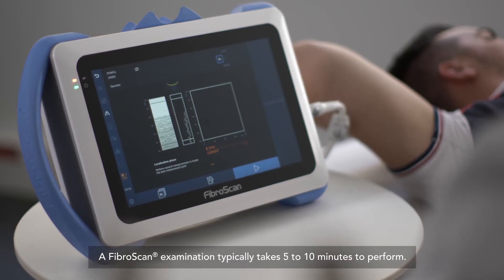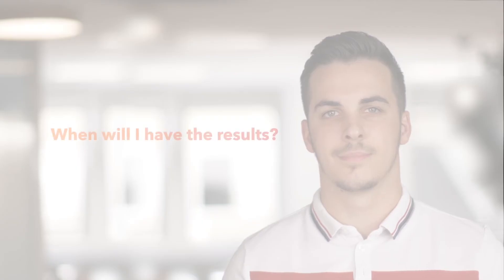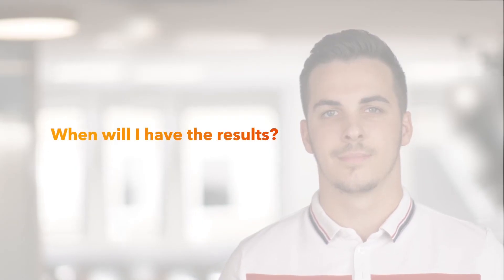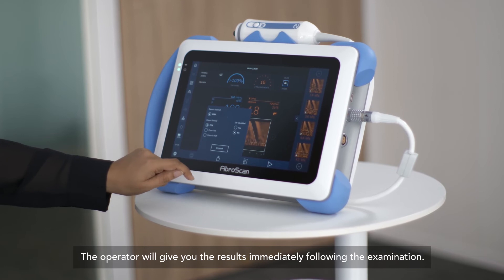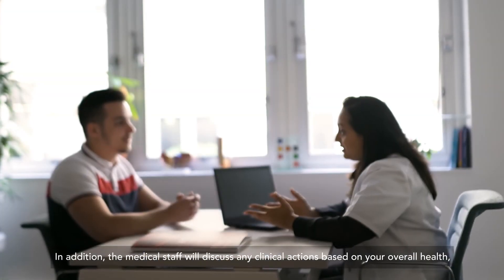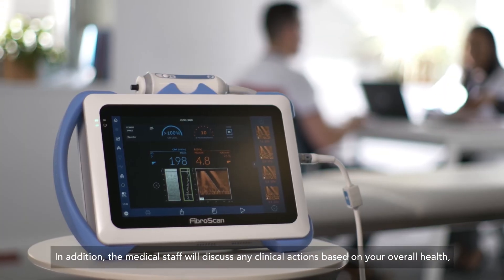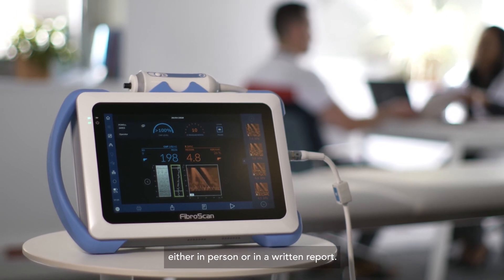A FibroScan examination typically takes five to ten minutes to perform. The operator will give you the results immediately following the examination. In addition, the medical staff will discuss any clinical actions based on your overall health, either in person or in a written report.